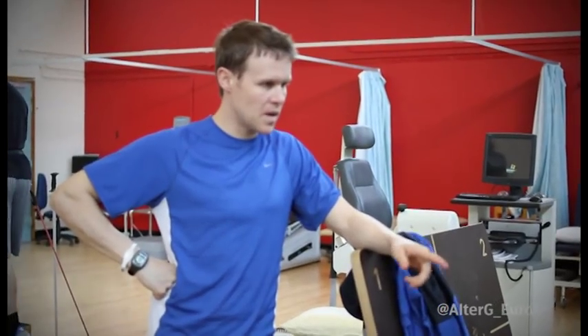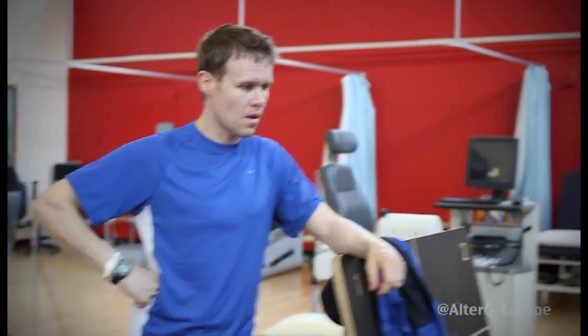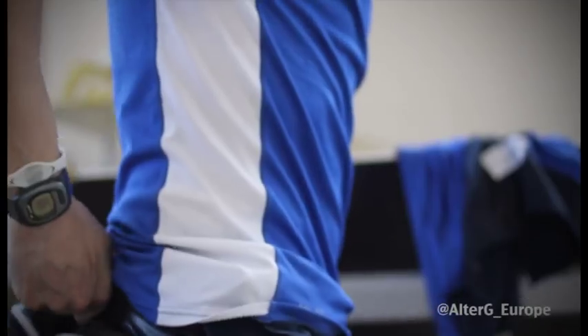The biggest issue for John was the weight-bearing stage. When John was at the stage that he was allowed to start to put a small amount of weight through his limbs, that's when he started using the Ultra-G. Over that three-month period he was able to progress up through weight-bearing.